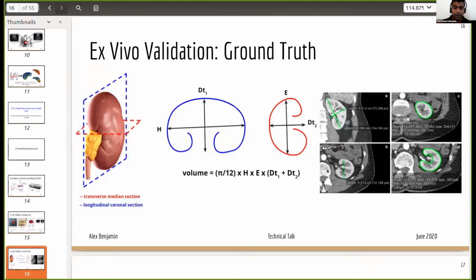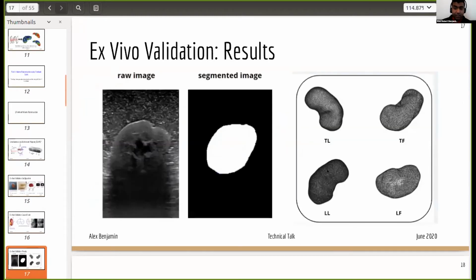And so we were able to compare the volumes we acquired with what is used currently in a clinical setting. In a clinical setting right now, you use CT, which is the image on the right. And if you do tend to use ultrasound, clinicians default to a method called the ellipsoidal method, which, as the name implies, assumes the kidney is an ellipsoid and estimates the volume based on gross measurements. We recently published a paper.